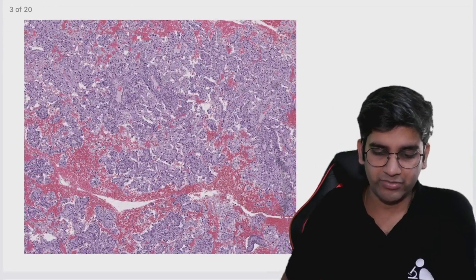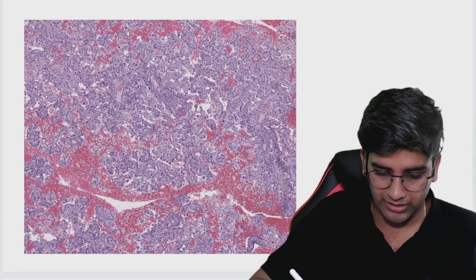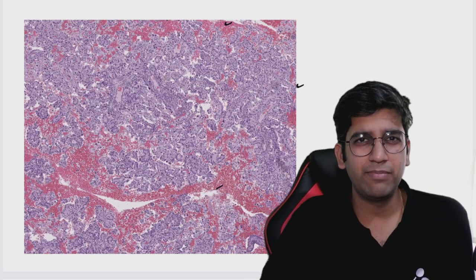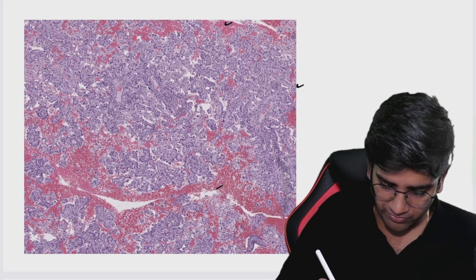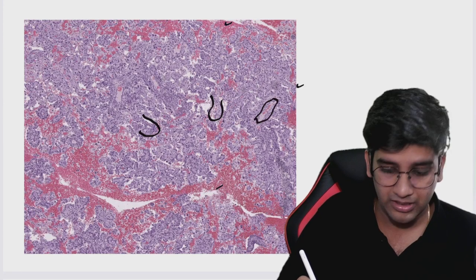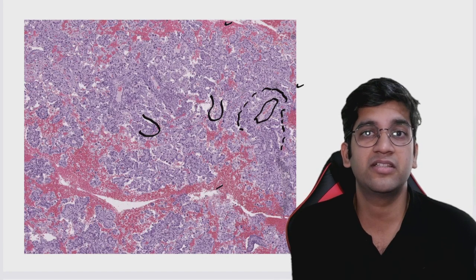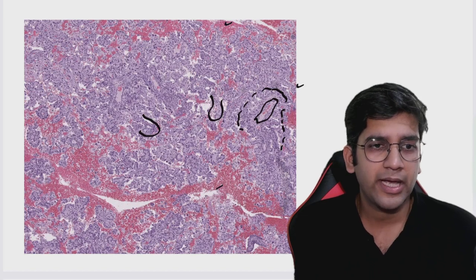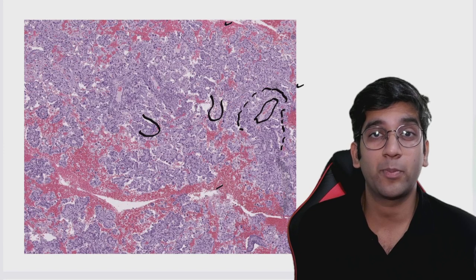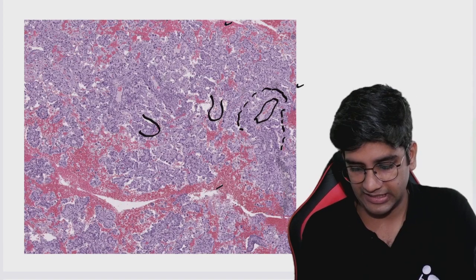This is a very low power scanner view image. You have lots of tissue here interspersed with areas of hemorrhage. If you concentrate a bit more, you can see a little bit of papillary areas even at low power — a big vessel and a fibrovascular area with lots of papillary projections. So what you're primarily seeing is papillary areas mixed with areas of hemorrhage. Most likely they are going to be tumor, because even at this power the blue color is a little bit more prominently seen, which tells me I'm dealing with a neoplastic condition.